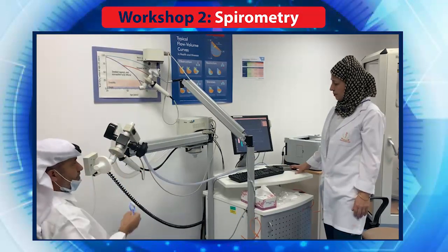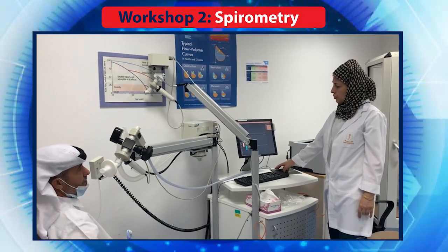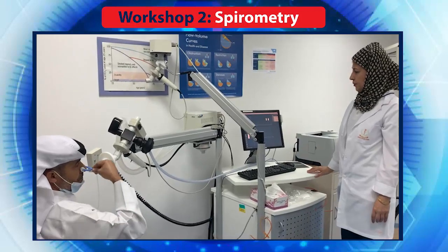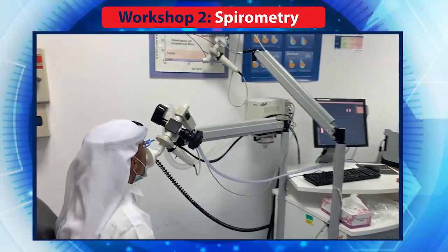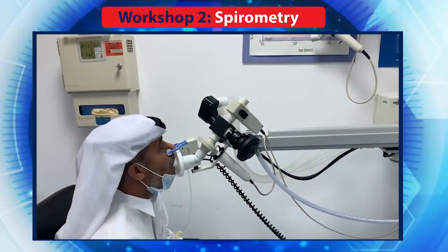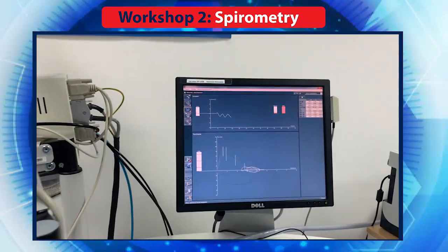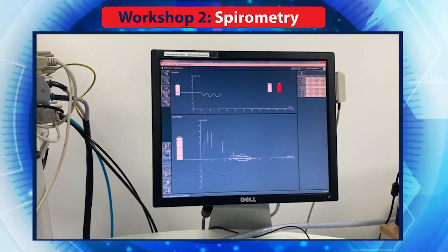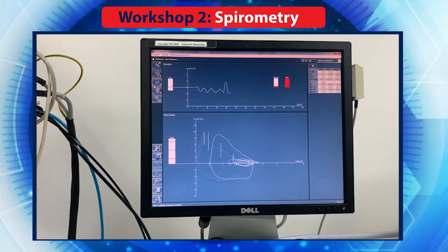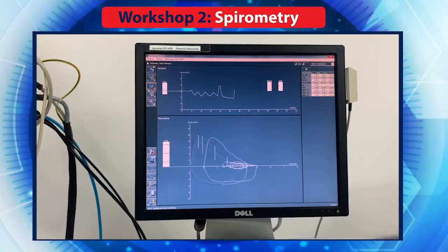Okay, so you did a good job, good effort, and you blew for 6 seconds. So if you are ready, we'll do one more time. Okay? Please. Normal breathing. Normal breathing. Normal breathing. Now, big breath. Big push. Go, go, go, go. Keep pushing, keep pushing, keep pushing. Big breath. Okay, very good.